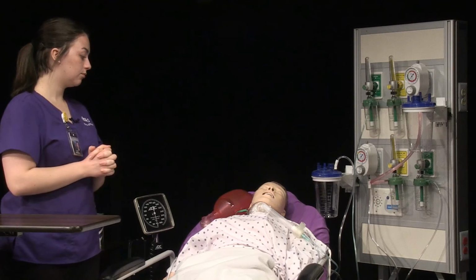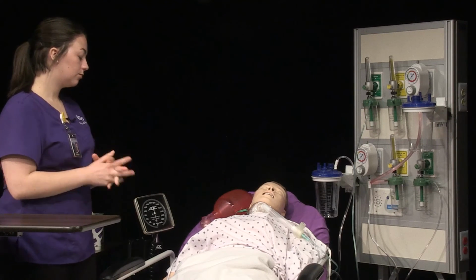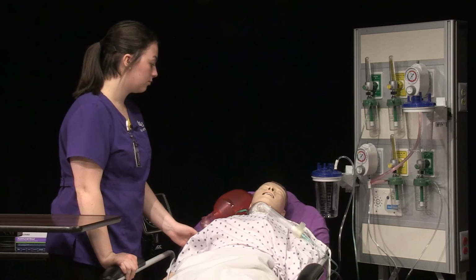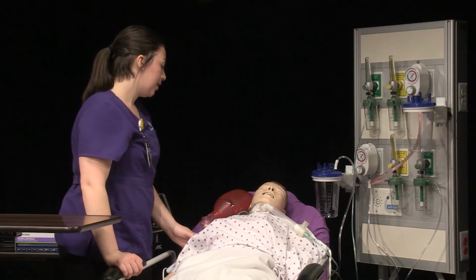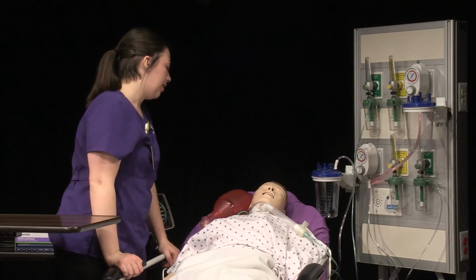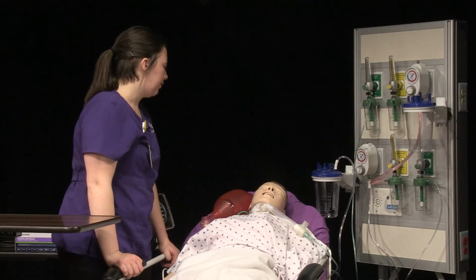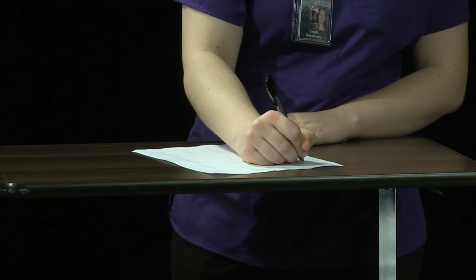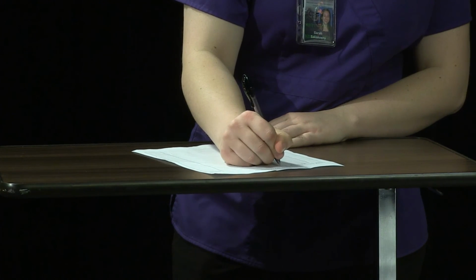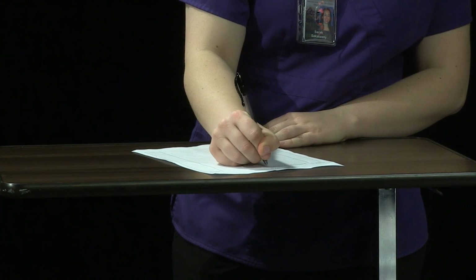Educate the patient. Instruct the patient to inform staff of respiratory needs, including need for additional suctioning or tracheostomy care. All right, Ms. Roberts, if you feel the need for any additional suctioning, just be sure to let us know. If you feel any shortness of breath or anything like that, let us know, okay? Document procedure, including the date, time, assessment, procedure, and patient's response to the procedure.